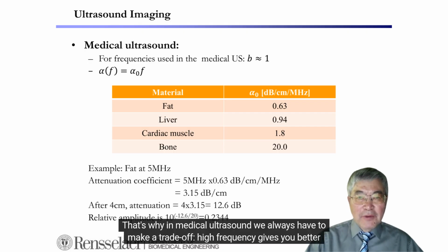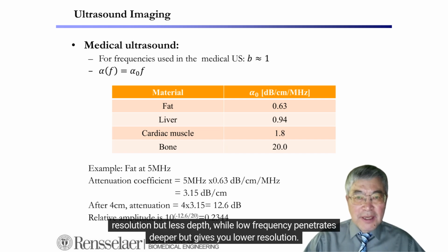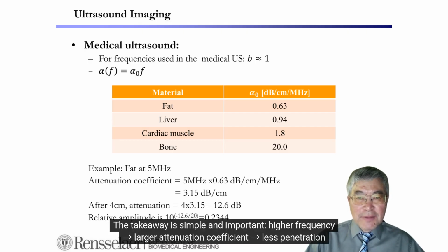That's why in medical ultrasound, we always have to make a trade-off. High frequency gives you better resolution but less depth, while low frequency penetrates deeper but gives you lower resolution. The takeaway is simple and important: higher frequency, larger attenuation coefficient, less penetration depth.